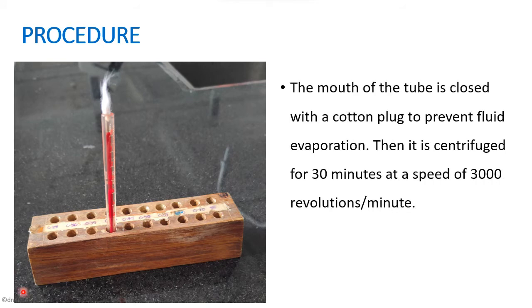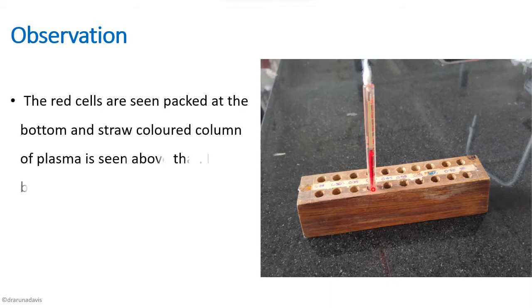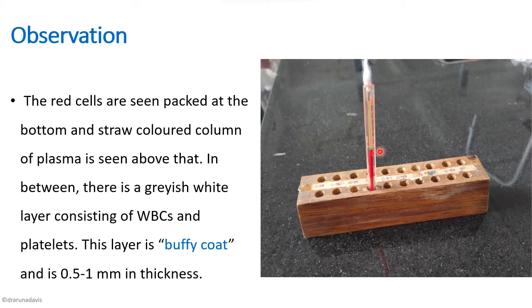We then centrifuge it for 30 minutes at 3000 revolutions per minute so that the RBCs settle down. Once centrifuged, we get a clear straw-colored plasma on the top and a red blood cell column at the bottom.